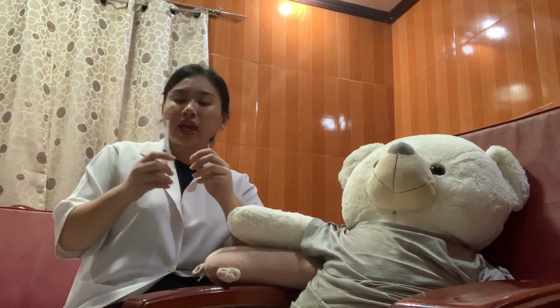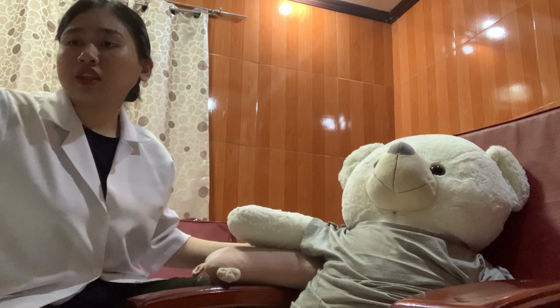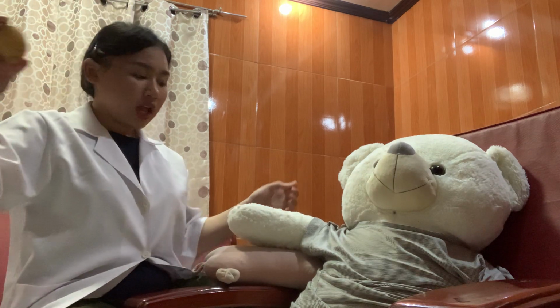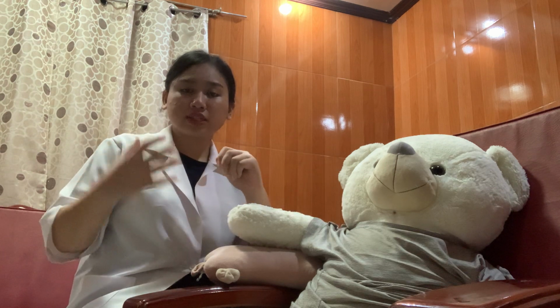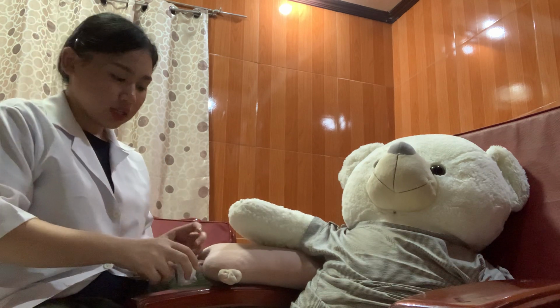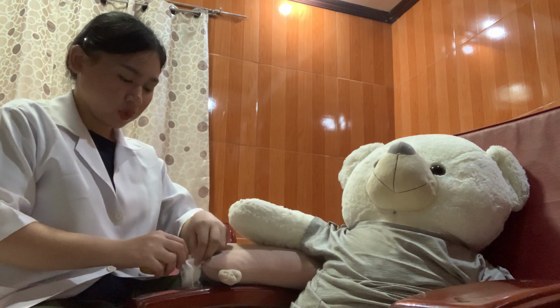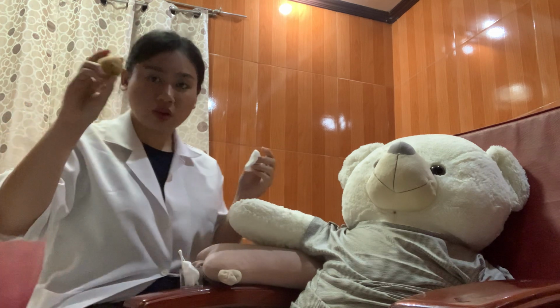After we heparinize this, we prepare the site and the fingers we use to palpate the site. So cleanse the wrist. For example, this is the wrist.